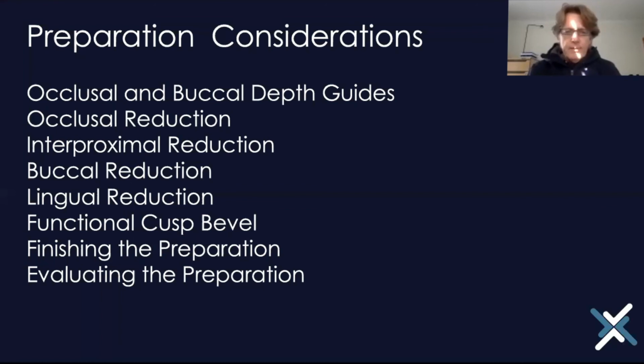These finely finished preparations really do give you a nice scan and a nice surface to work with, and you can generate good crowns. In terms of evaluating your preparation, you don't have to tell anybody what you're seeing. Just go through your little checklist of all the things that we've given you here and make sure that you've done all those mental checks prior to doing your scanning. Okay, so let's look at one or two little cases.